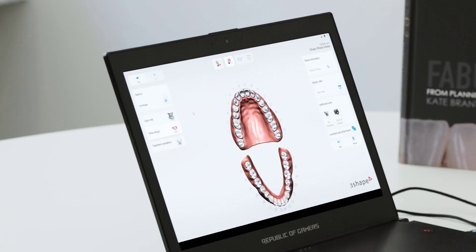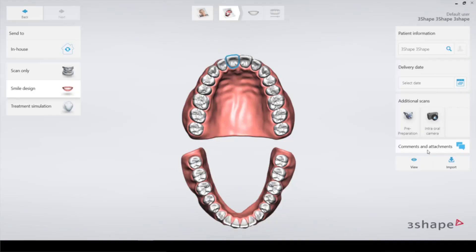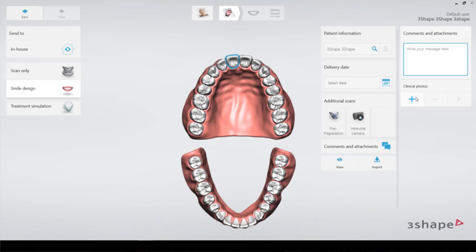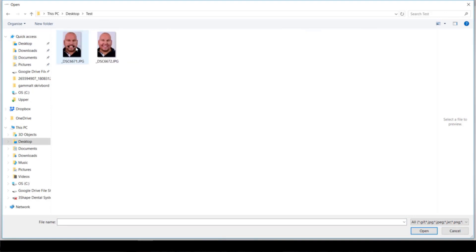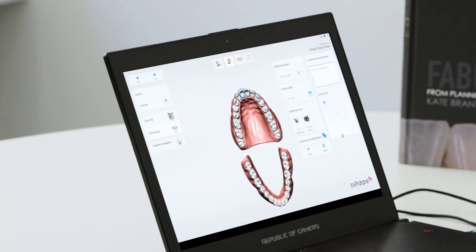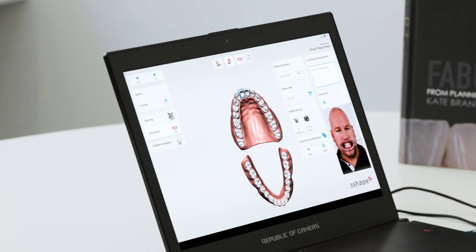We're going to have a smile design and what we need here is to select one tooth. On the right side, under comments and attachments, we click that and add clinical photos using the plus button. So we import the two pictures we need and then we just continue.